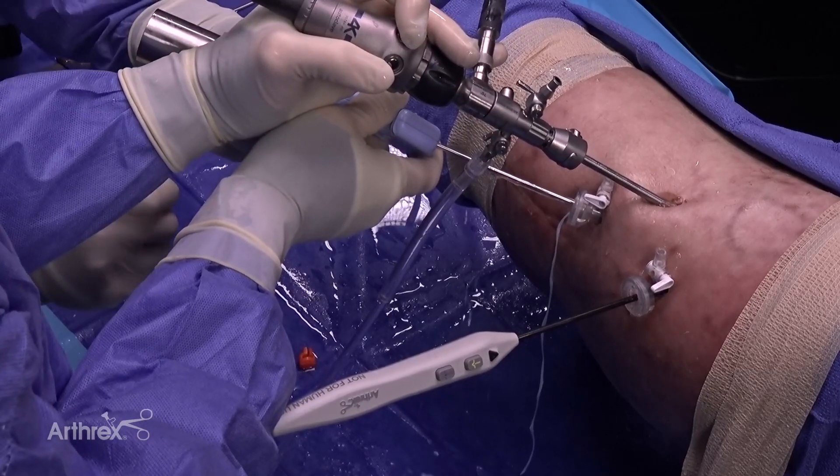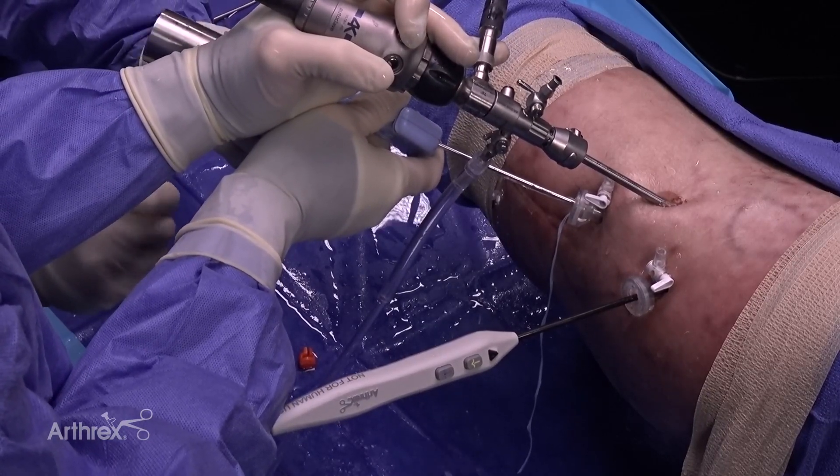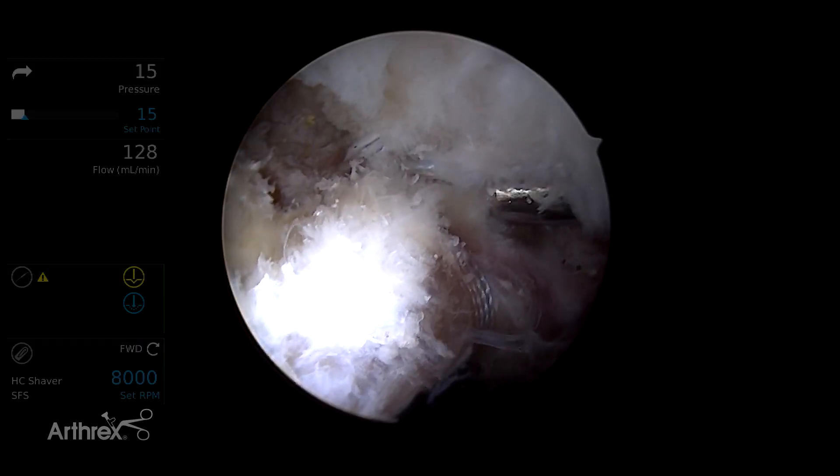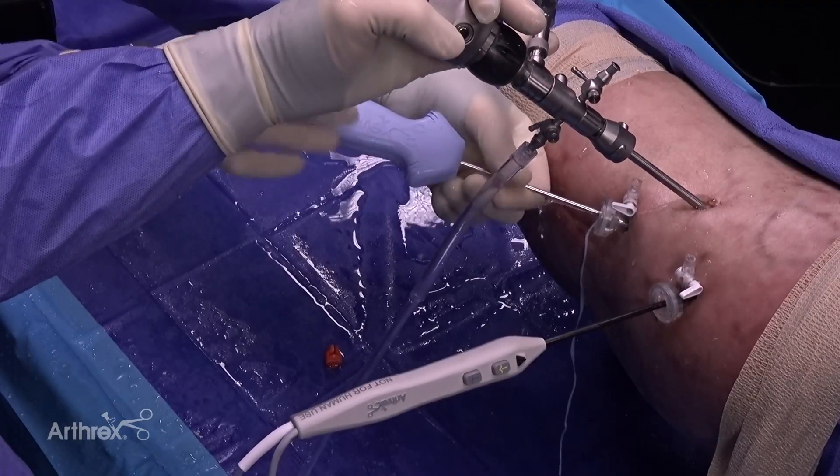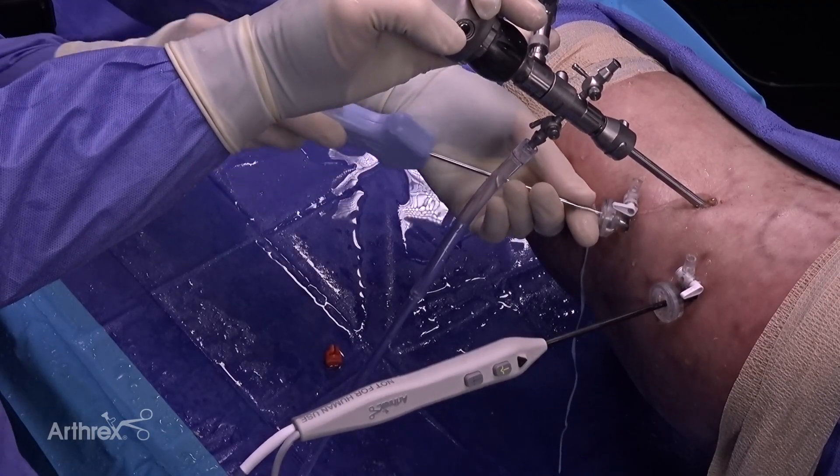The anchor has a laser line which allows appropriate positioning. Once that laser line is flush with the base of the anchor, it is impacted into place and then unscrewed. With slight pulling, it will slide right out.